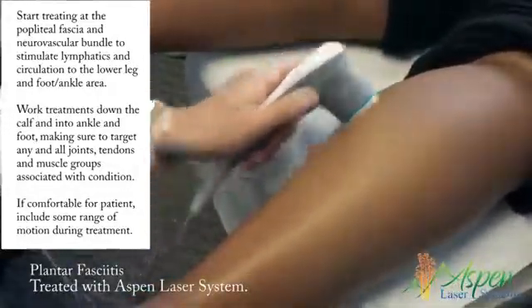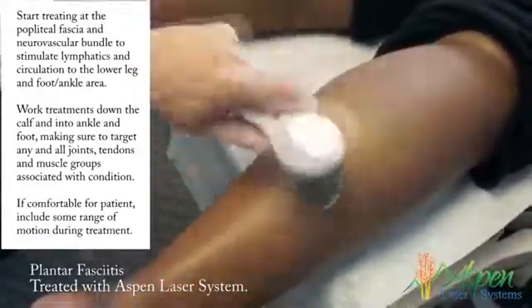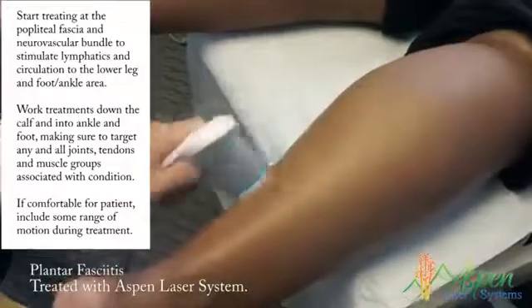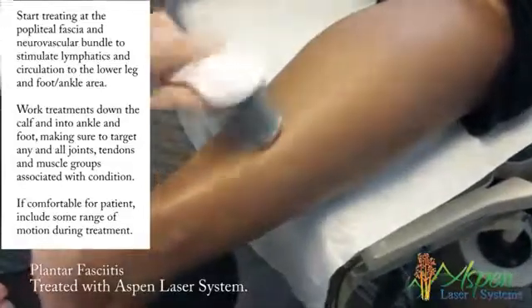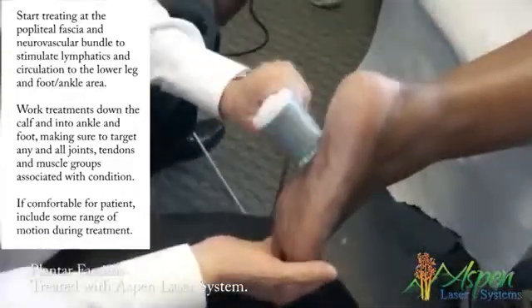Cells need ATP as an energy source for any type of biochemical healing. It will also block pain. This is good for water absorption and hemoglobin absorption, so she should get a lot of relief. I'll do the heads of the gastrocnemius, I'll do the soleus. If it gets too warm or it's too ticklish, let me know.